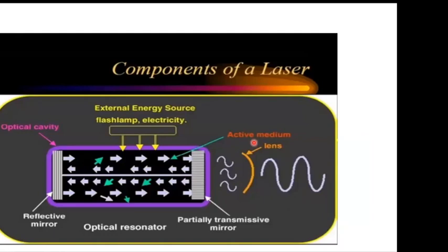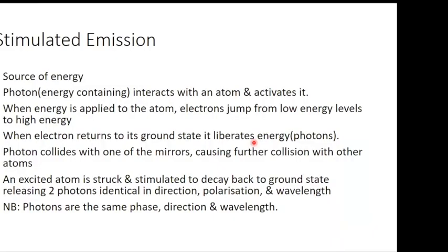Okay, so after this spontaneous emission from an external source of energy, with continued source of energy, and also remember there are already produced photons from electrons moving from a region of high energy to a region of low energy. They emit energy in the form of photons. These photons will then interact with other atoms that are already excited, and they further activate them.